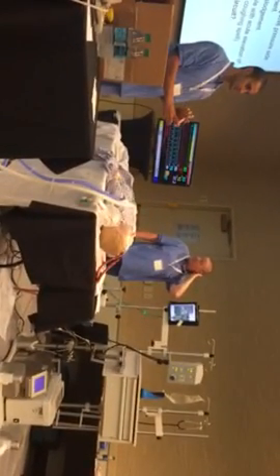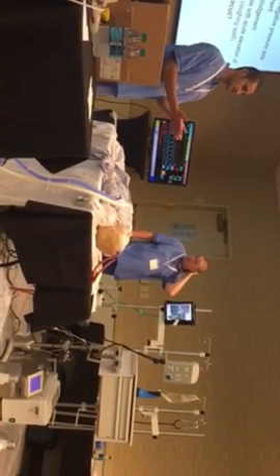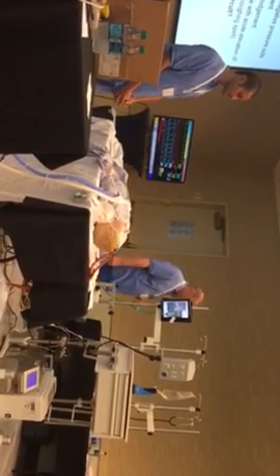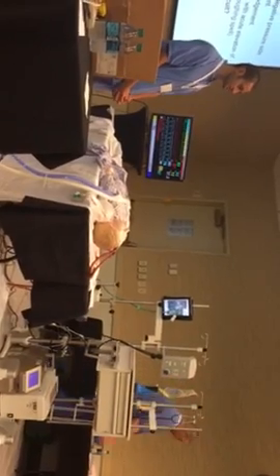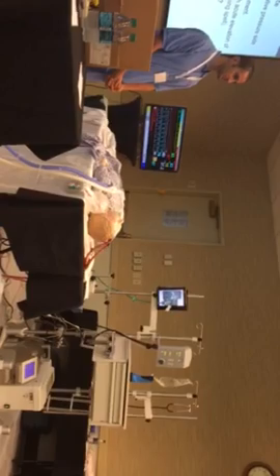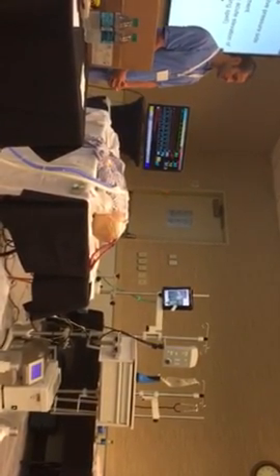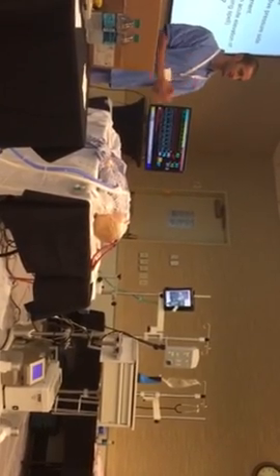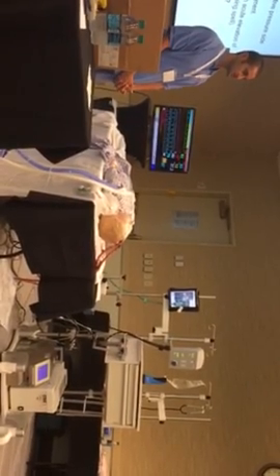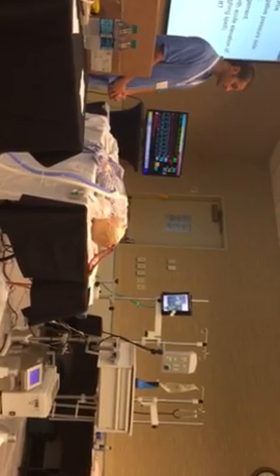Okay, so the first question is pre or post oxygenator, and then the second, are you VV or VA? And the difference, of course, is with VV, VV would be safer. Yeah, in theory on VV, you have lungs that can catch air emboli, unless, of course, you have a PFO. Don't forget, a significant portion of normal people have PFOs. And with RV failure, and with respiratory failure and elevated PA pressures, more of that population has PFOs as well. So it's not necessarily safe on VV, but less concerned than VA. VA, you would stop.